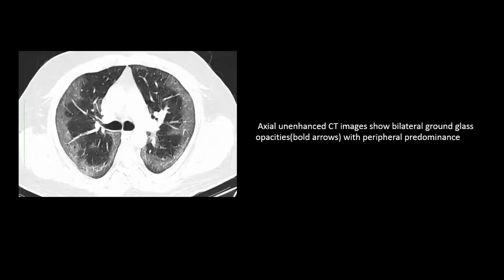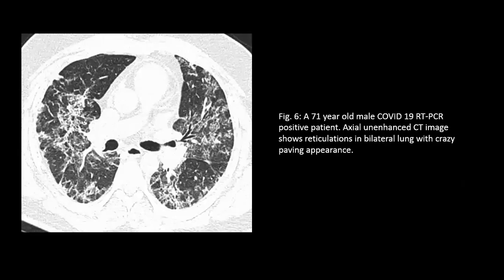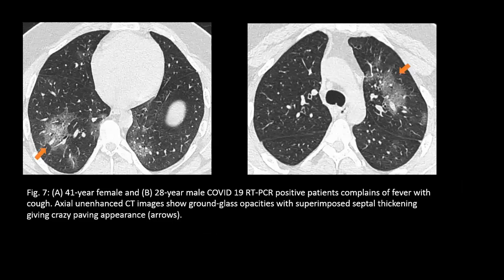In this axial CT, bilateral ground glass opacity with peripheral predominance is shown. The second finding is reticulation, seen in 71% of patients, probably due to lymphocytic infiltration of the interstitial tissue with interlobular septal involvement. Crazy paving pattern was seen in 59% of patients in our study; it consists of GGO with thickened interlobular or intralobular septa superimposed over the GGOs. An axial CT shows bilateral reticulation with crazy paving pattern, and another CT shows ground glass opacity with superimposed septal thickening giving the crazy paving pattern, as indicated by the arrows.